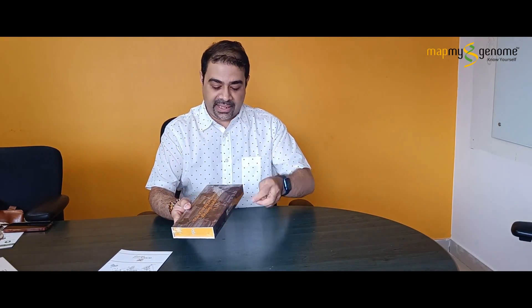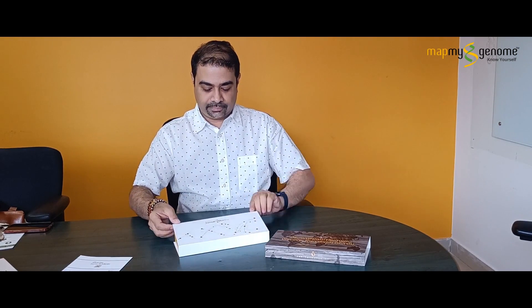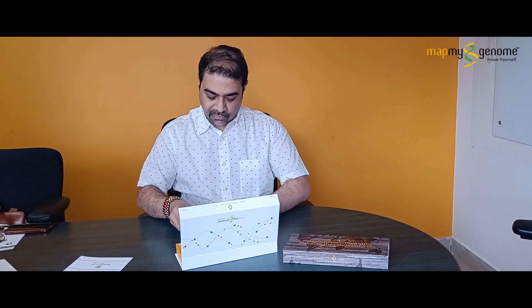It comes to you in a nice sealed packet, guaranteed that it's not been tampered with. Pull out the sleeve — there you have the nice box. Let's see what's inside. There's a lovely message from the CEO of Map My Genome. Now I need to remove this form. It's a very extensive detail form that will take a few minutes to fill up, but please do it very diligently because the information here will have an impact on your test.